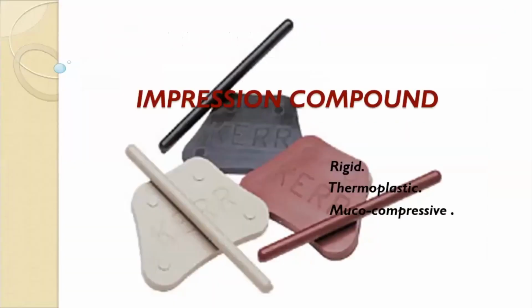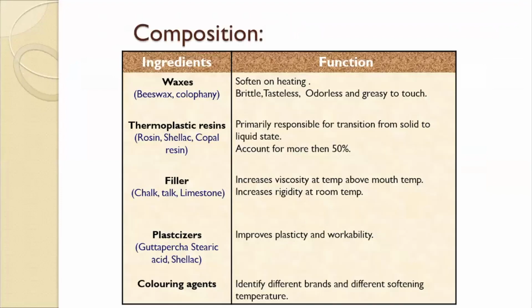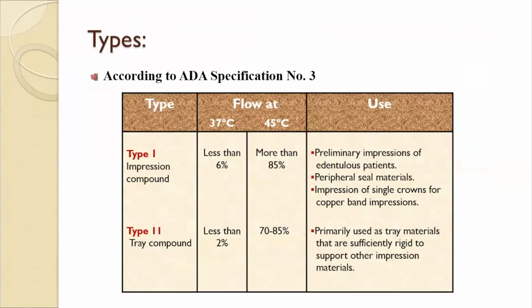Impression compounds are rigid, thermoplastic, and used with compressive techniques. Impression compounds are also called modeling plastics. It is a thermoplastic material and is supplied in the form of sheets and sticks. Basically this is the composition: waxes, thermoplastic resins, fillers, plasticizers, and coloring agents.